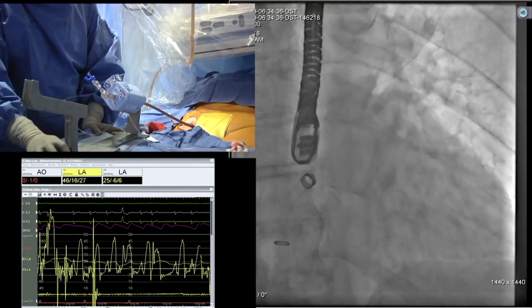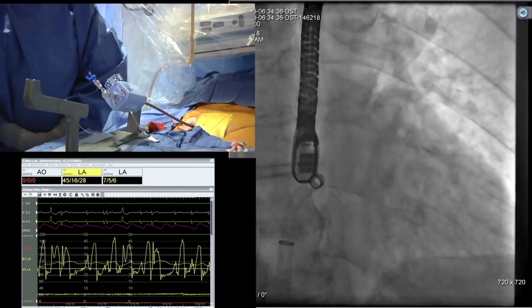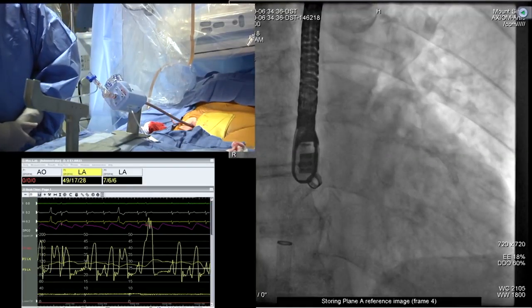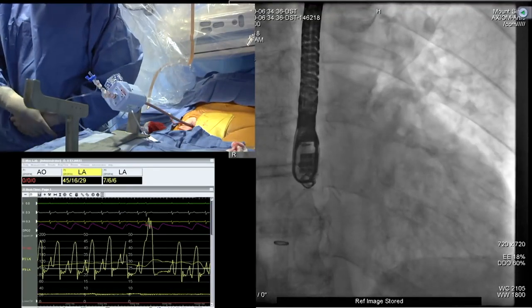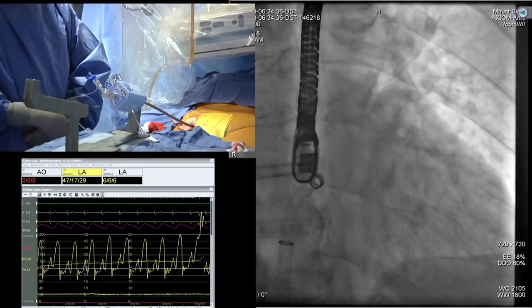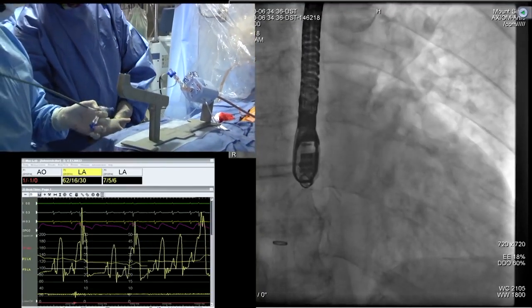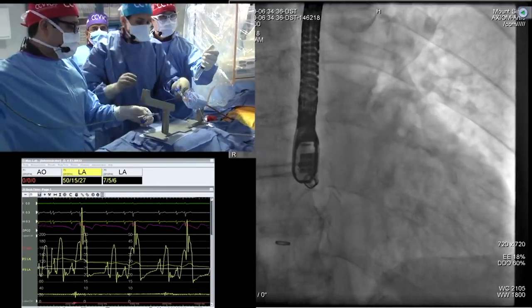Before we also do this in our case, one thing we do before is to have the pulmonary vein flow measured to see if we change something during the case. Is it something you do routinely in your cases? We routinely don't do that. On echo, she does it. We do it on echo because after you place the first clip, your color flow jet can actually get distorted, so you can falsely think it's actually getting worse.